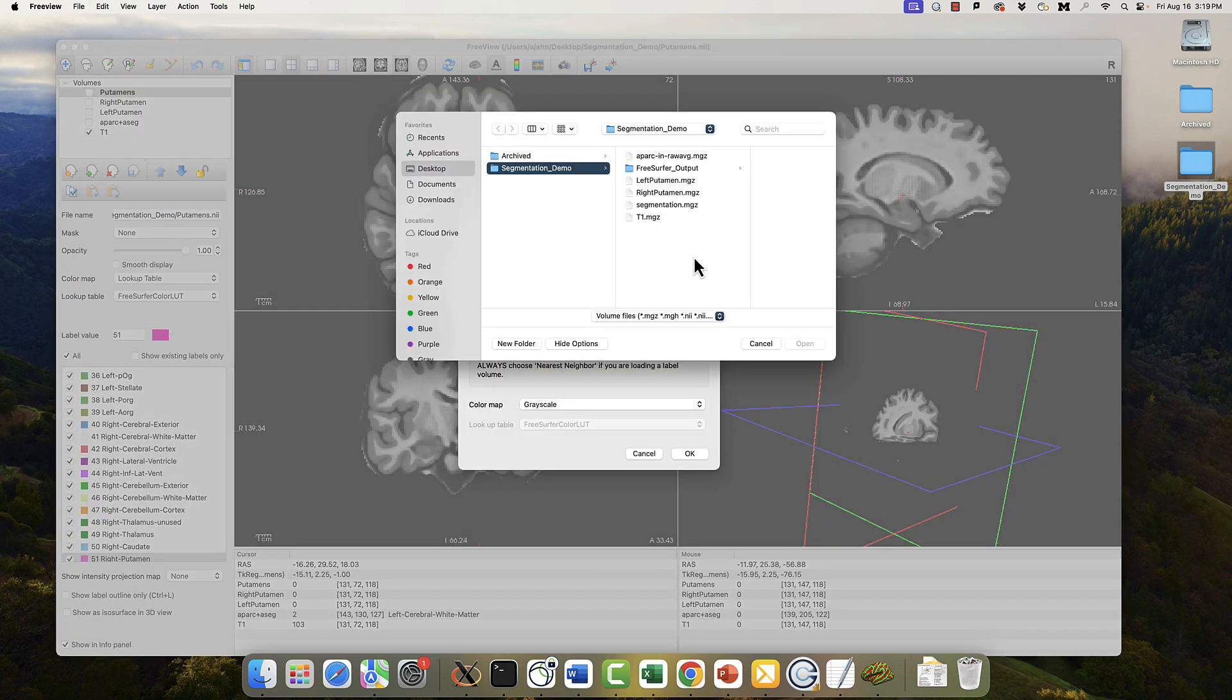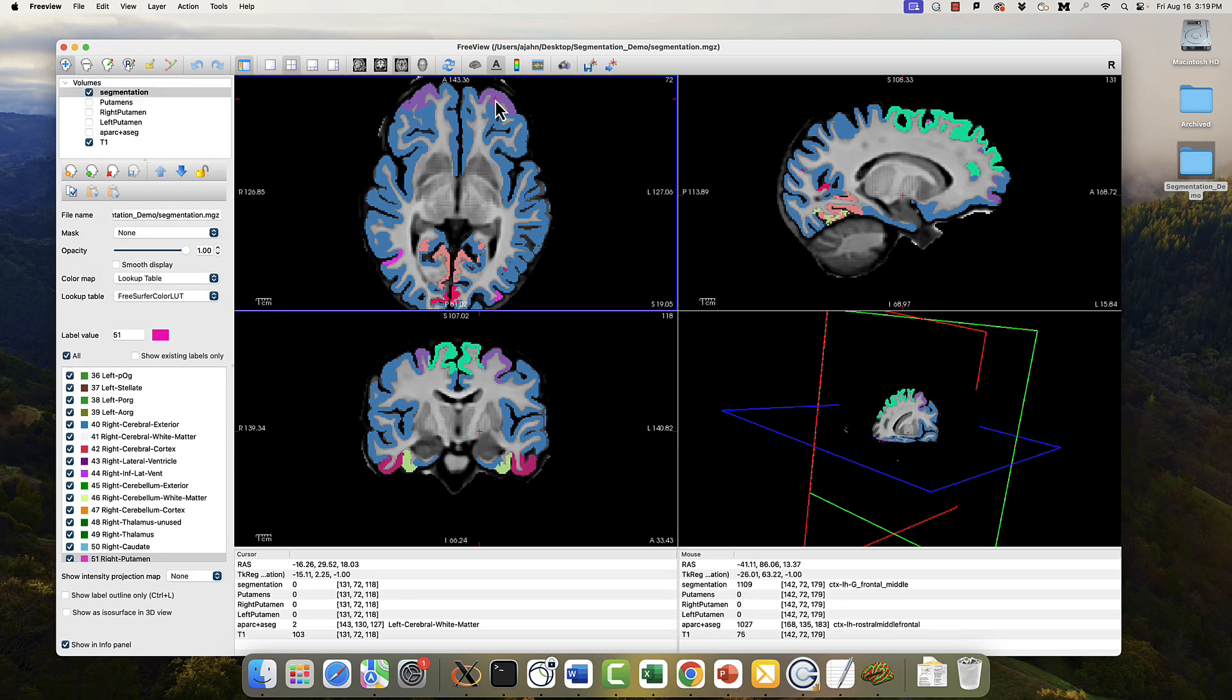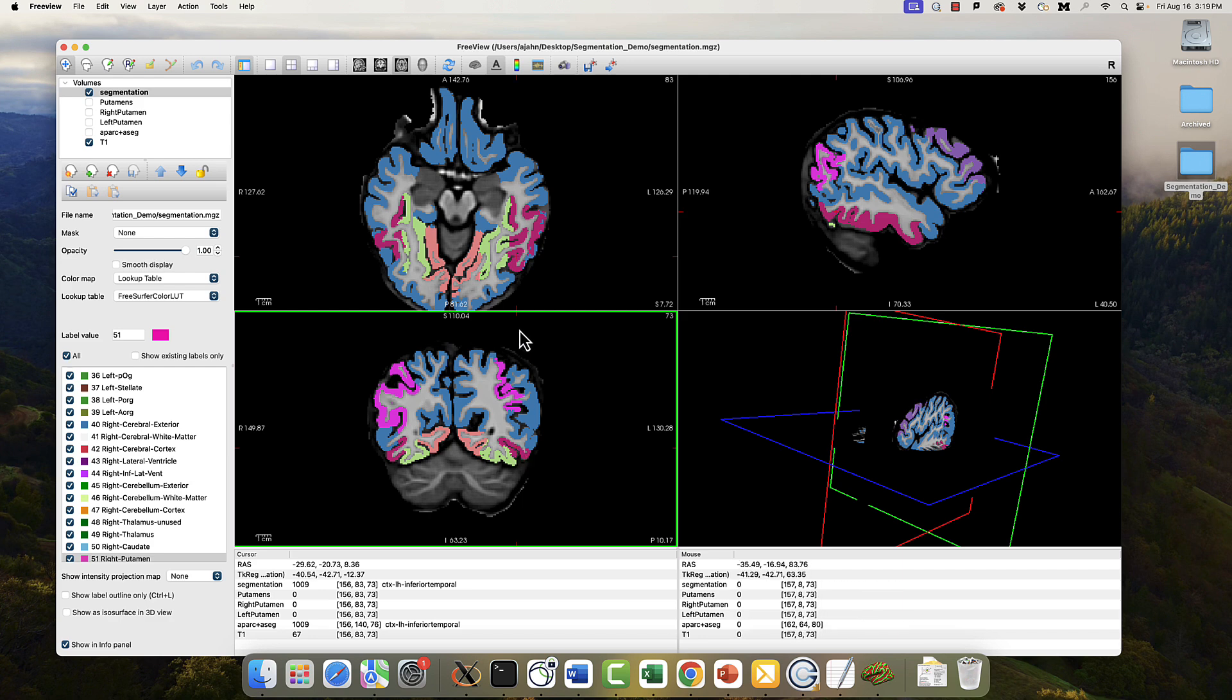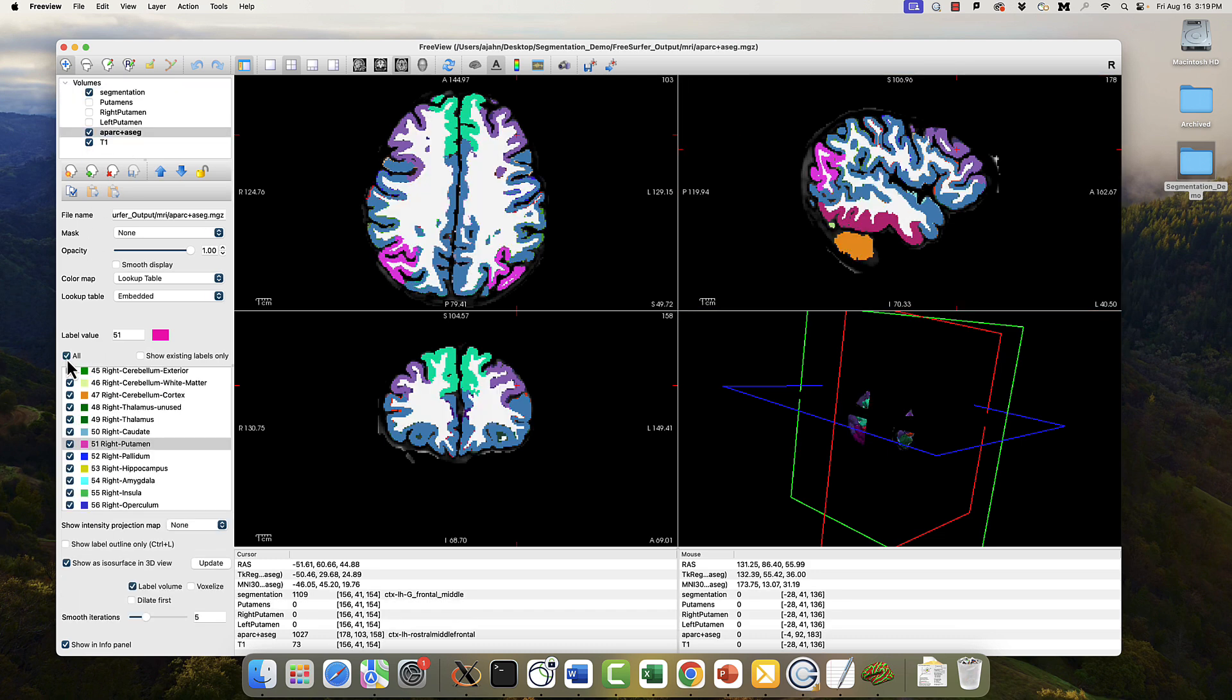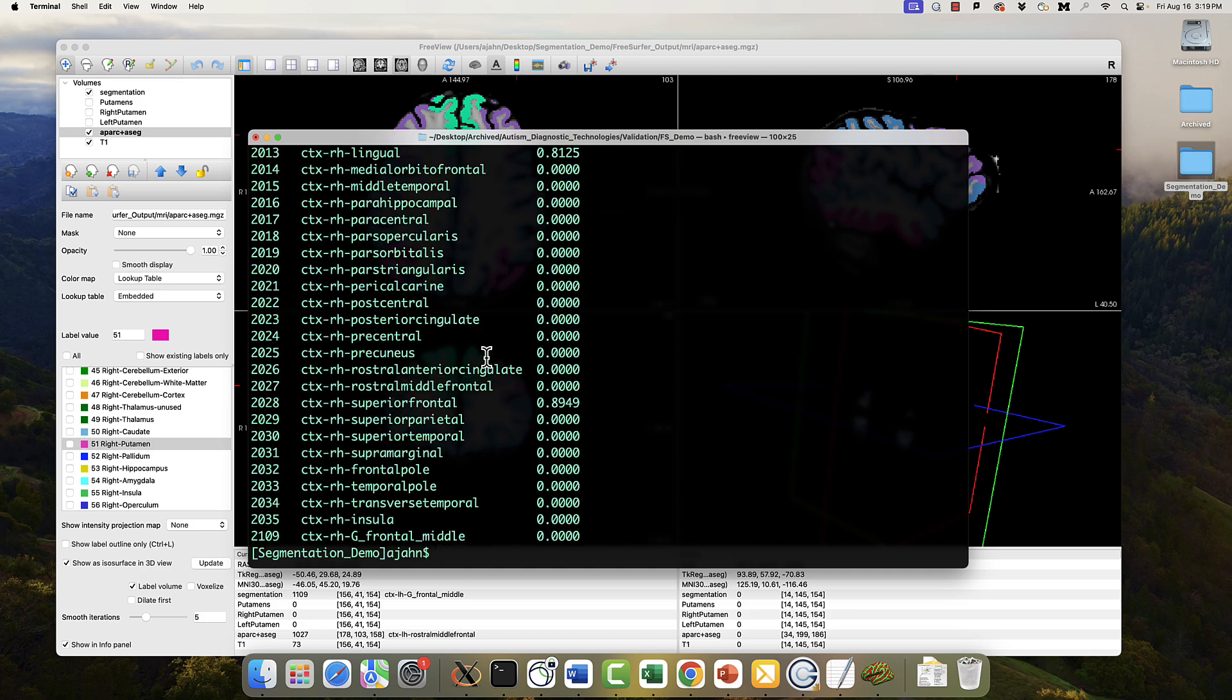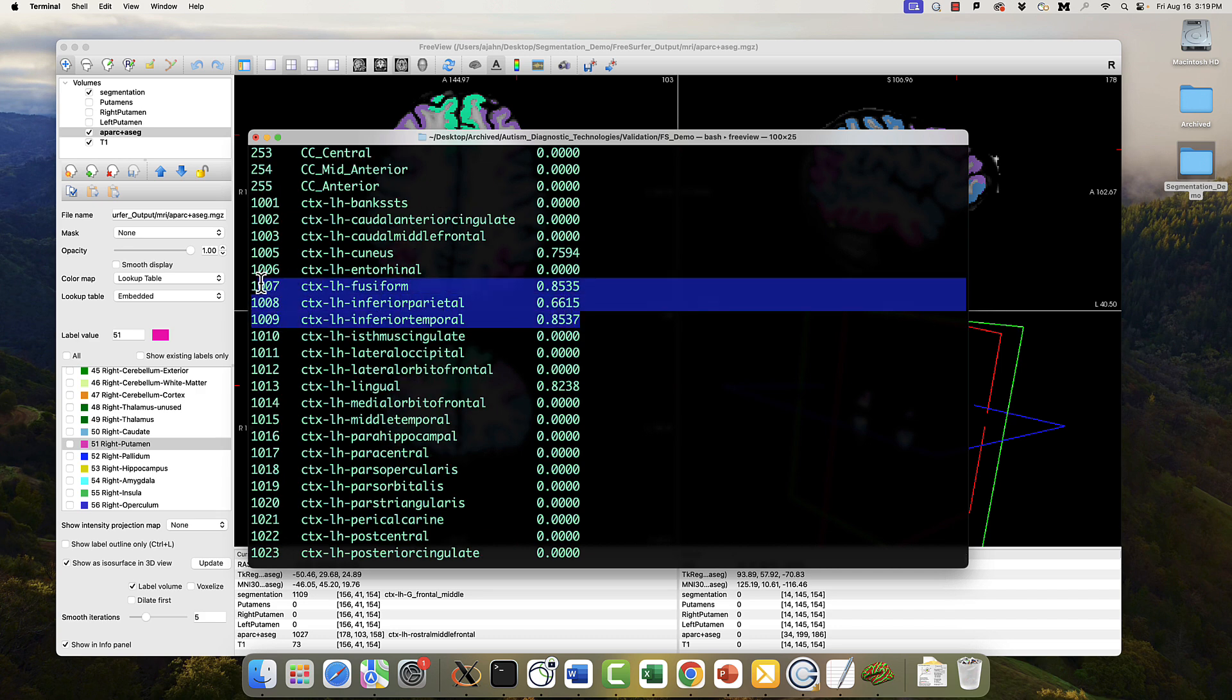Now this segmentation file, you may wonder what it is. This is, I think, roughly a dozen structures that were segmented by hand, which included things like the fusiform cortex, inferior temporal cortex, rostral middle frontal cortex, and a few other ones in both the left and right hemispheres. And what we're going to do is compare that to the APARC plus ASEG segmentations, which you can see when I highlight them below. So when I run this, the output is going to be a dice coefficient score for each structure. How much overlap was there between the automatic output from FreeSurfer and the manual segmentation that I did? And you'll see scores ranging from around 0.6 to 0.85 roughly.